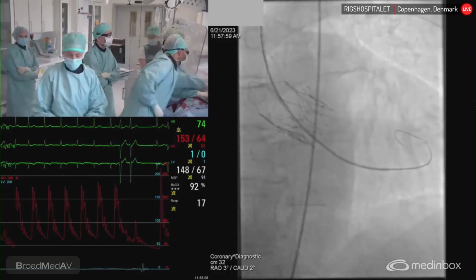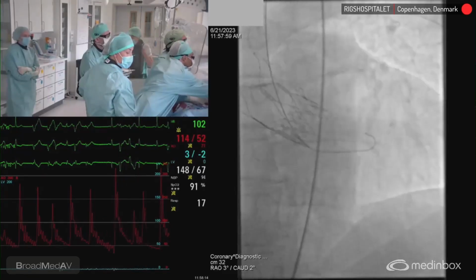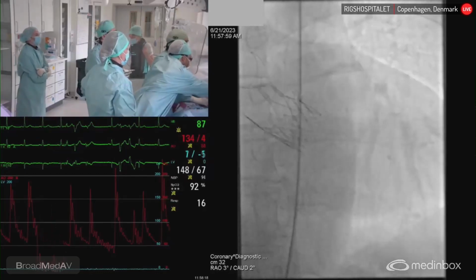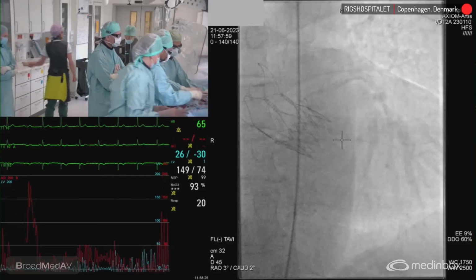All right. The only thing we had there, as you could see, despite our nice and good, actually even double pre-dilatation, we had a pretty severely underexpanded valve with the deployment. But that's why we didn't want to take chances and crossed with a balloon on the other axis.